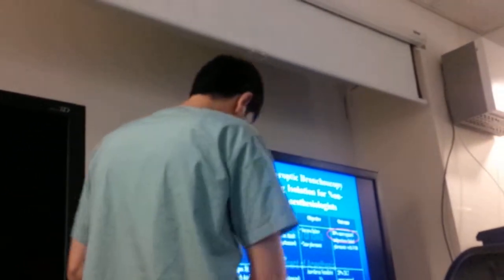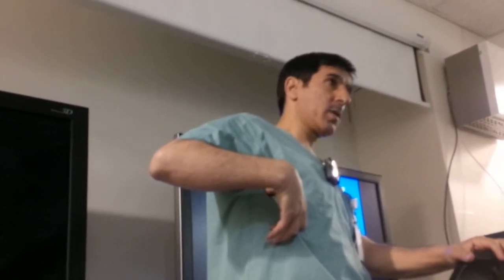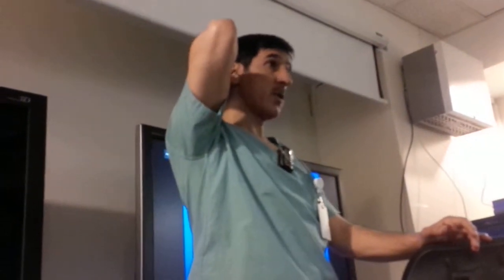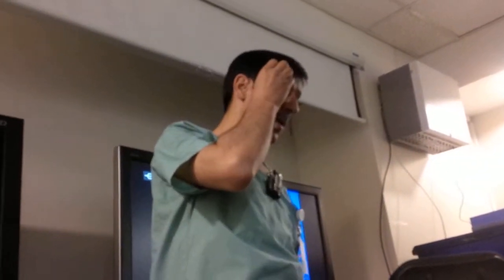Let me tell you a case. There was a case of scoliosis, anterior approach. In scoliosis, usually they are young patients, adolescents, and the anterior approach is for scoliosis on the thoracic side, the upper side. They go anteriorly with the left side usually. And we put the bronchial blocker. I just went in, it was not my theater. We went in and we put the bronchial blocker in the left side. It was really confirmed that it's in the left side. And when we auscultate, we see the air entry bilateral.